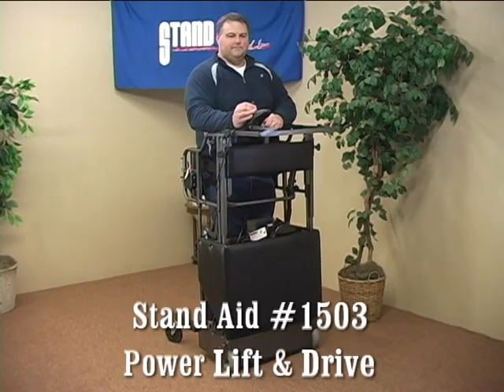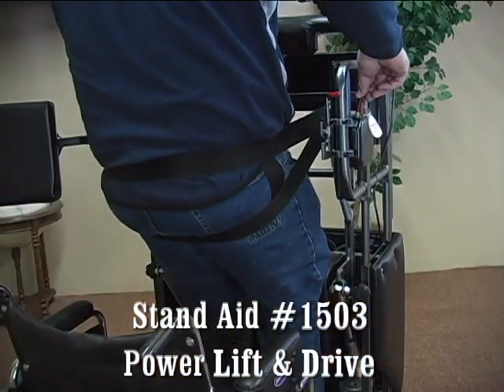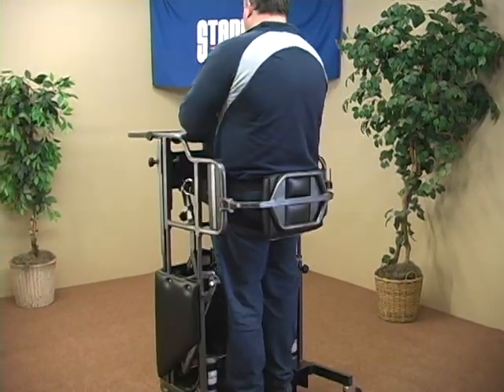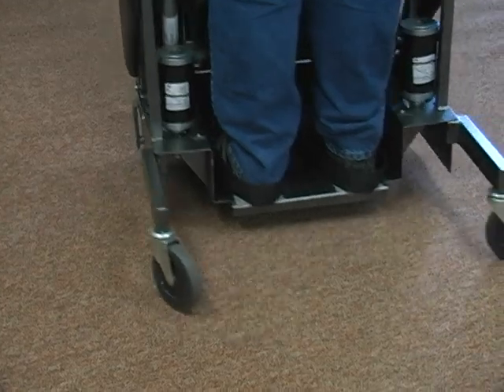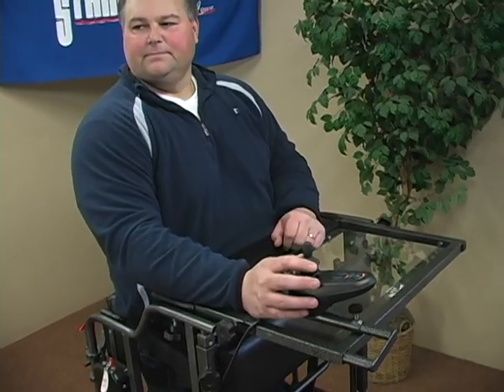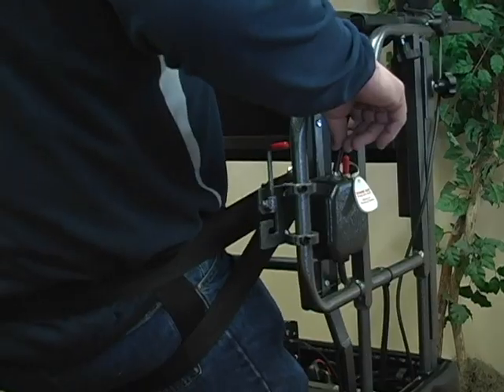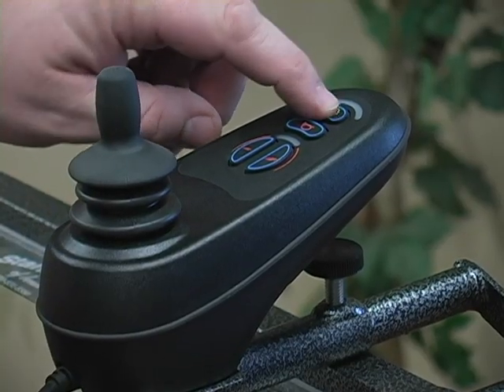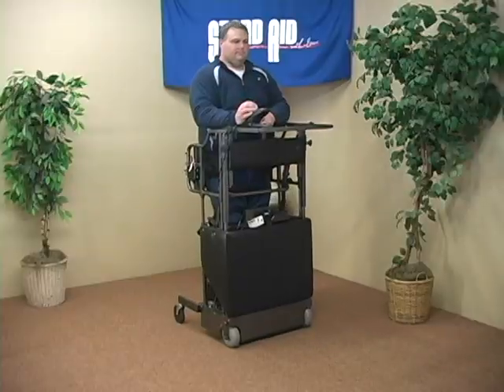The Stand-Aid Model 1503 is a power lift and joystick-controlled power drive standing system. The Stand-Aid difference comes to life with the Model 1503. This unique standing system features the power lift system and the freedom to move the patient while standing, with the addition of a joystick-controlled power drive system.